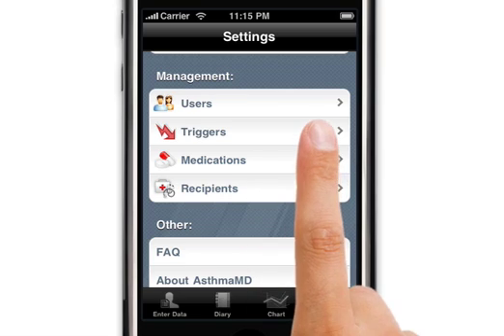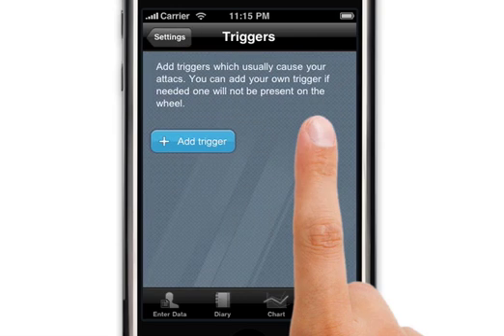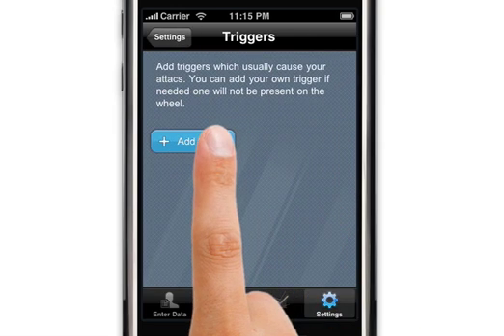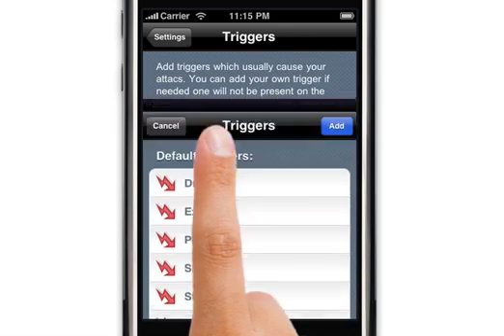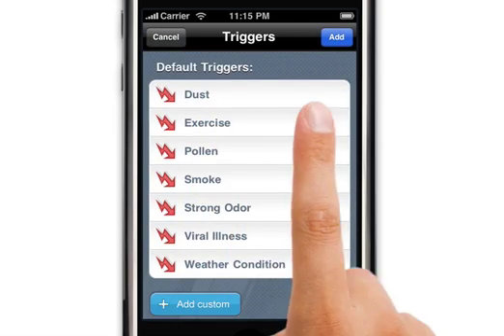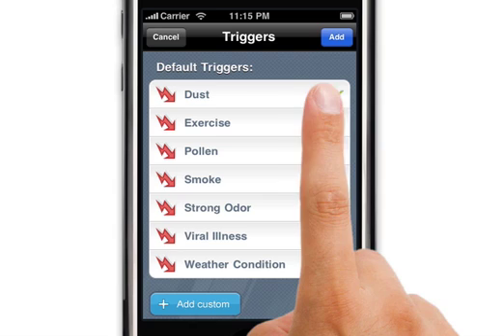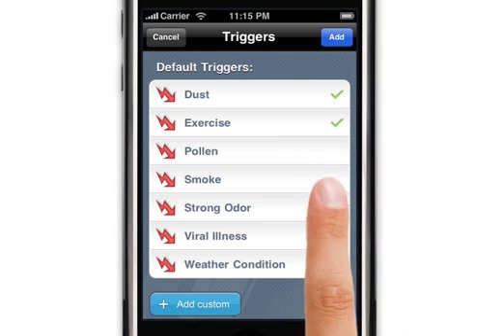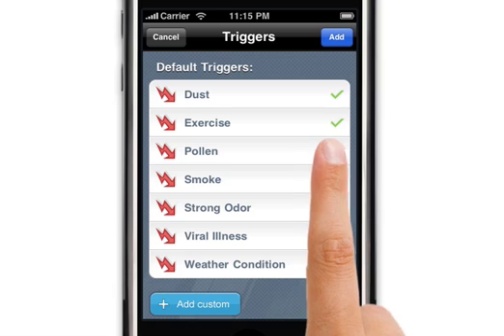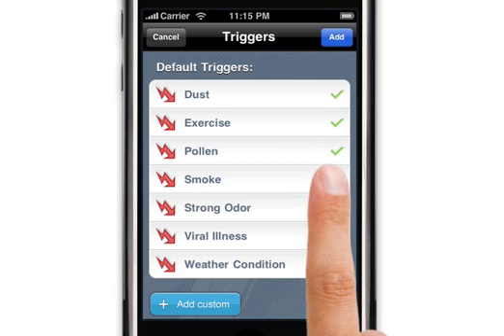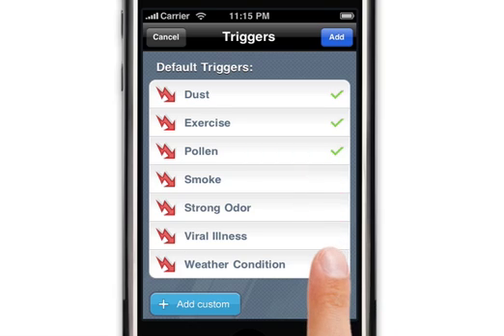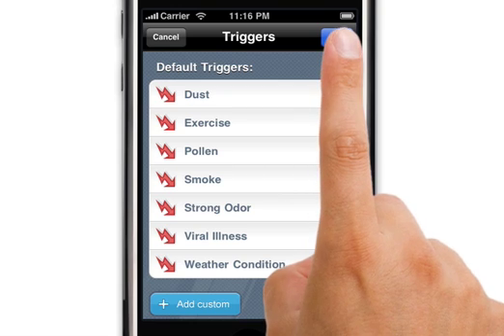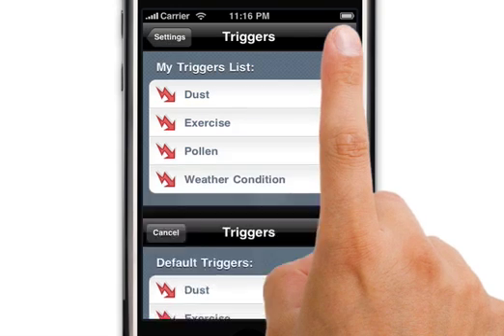Starting with the choices under the management, we start with the triggers. You can add each trigger based on your sensitivity and your history, depending on the type of asthma that you have. Once you've chosen the triggers that you have, you can also add custom ones if necessary.